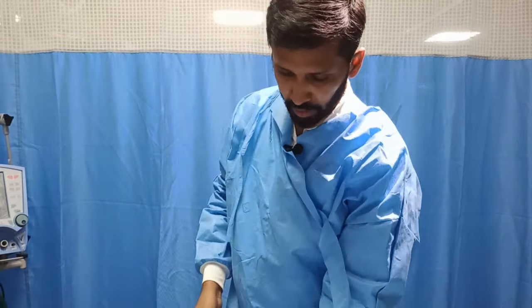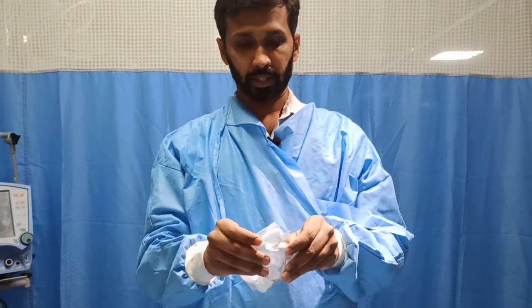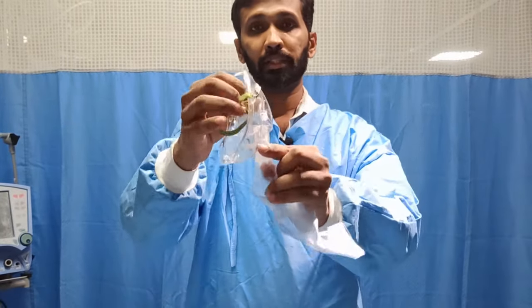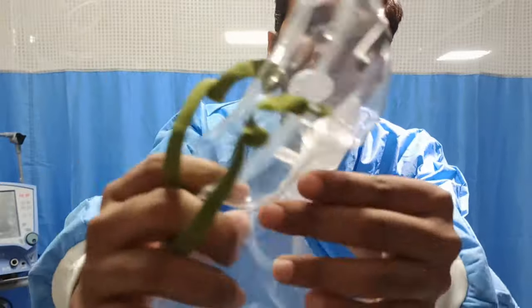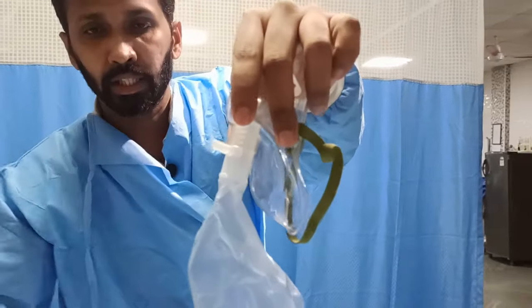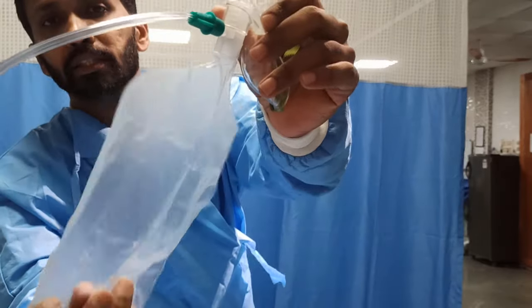Another most important one is the NRBM, the non-rebreathing mask. The non-rebreathing mask consists of a mask, as I said usually, along with a reservoir. On this reservoir, you can see one port where you connect the oxygen tube. Once you connect the oxygen tube, the oxygen will fill this reservoir.